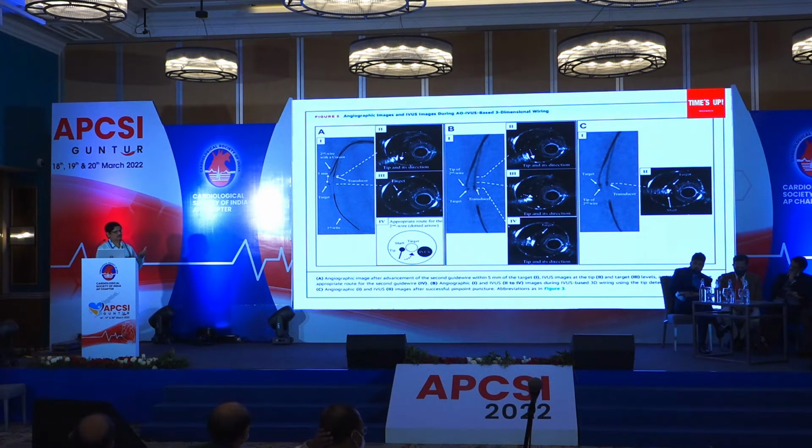And of course, the fourth one, where OCT can't negotiate across calcific angulated lesions because of its sleekness. We have seen this many times in practice. Then with IVUS, after adequate lesion modification, you can negotiate and give the optimal image. Thank you.